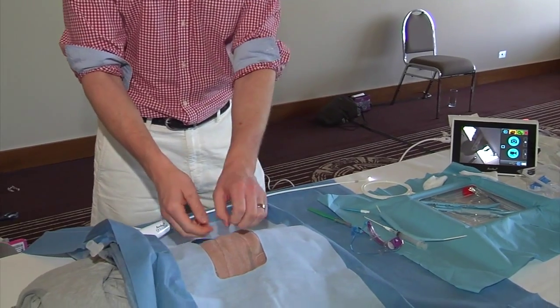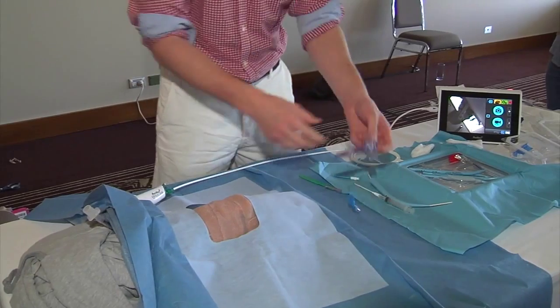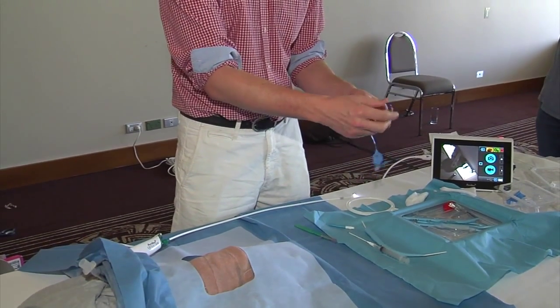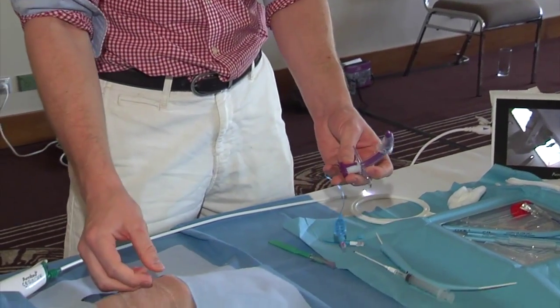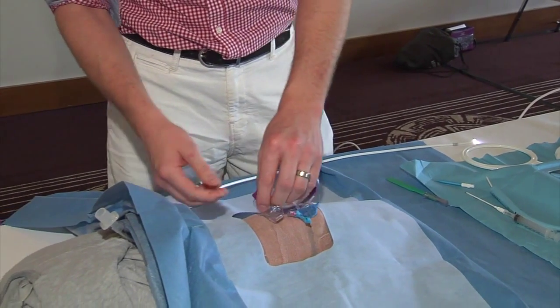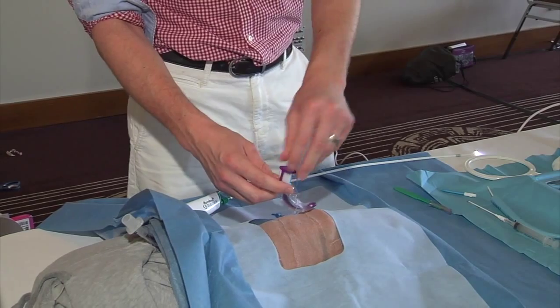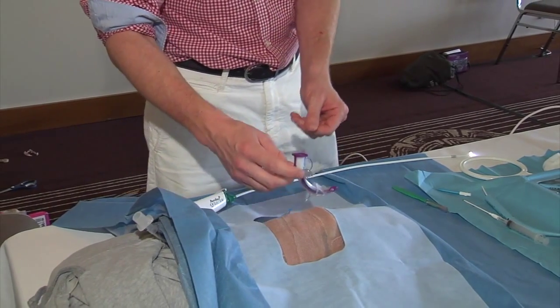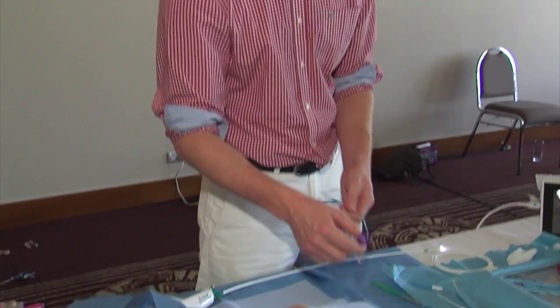Once the dilator is in, take it out completely — both the white and blue parts — leaving just the guide wire in. Then introduce the tracheostomy tube with the purple inner cannula over the guide wire and slot it into the airway. Keep hold of the tracheostomy tube, remove the purple inner cannula, and you can then put the bronchoscope down to suction any blood and secretions. Then insert the inner cannula and use end-tidal CO2 to confirm you're in the airway.